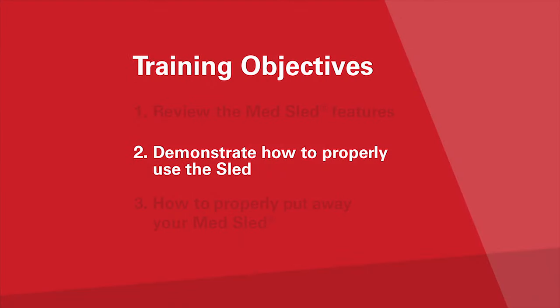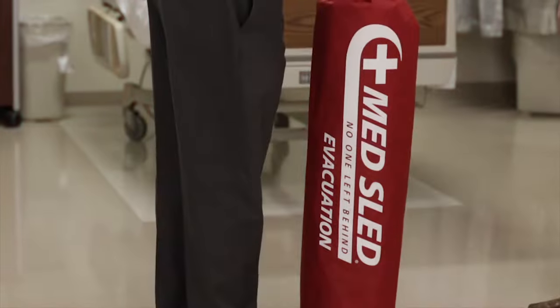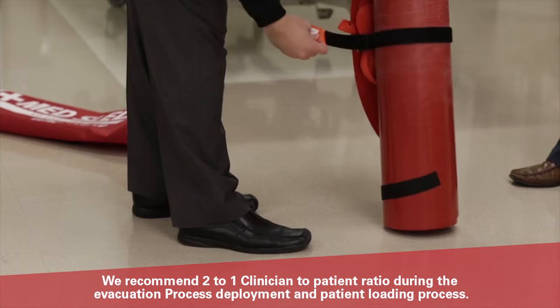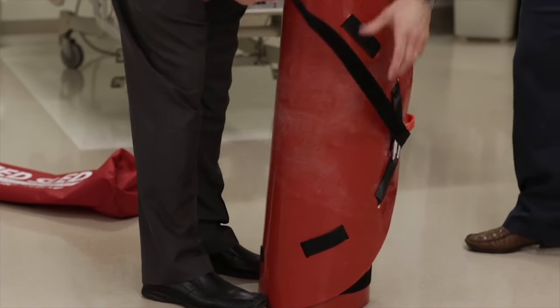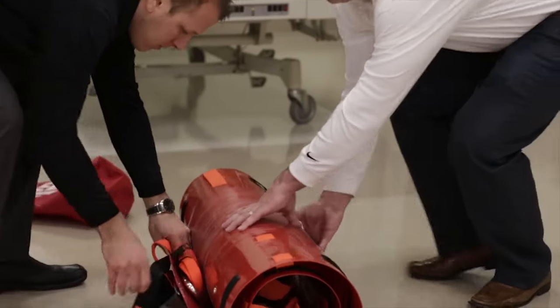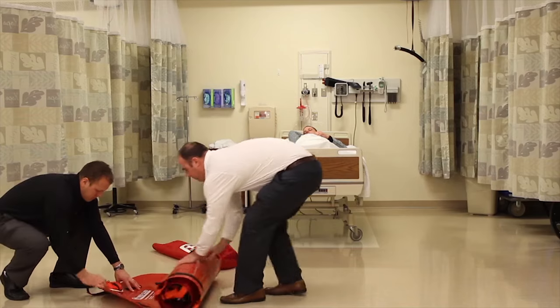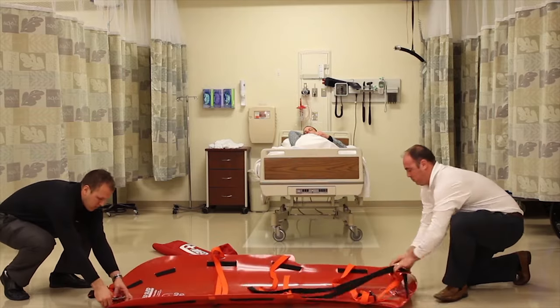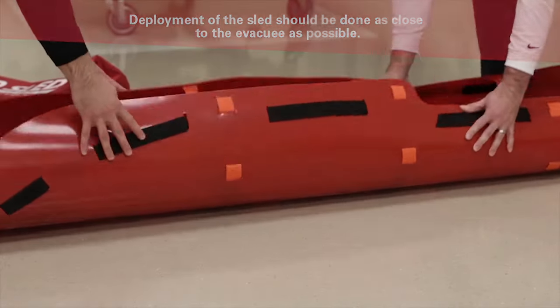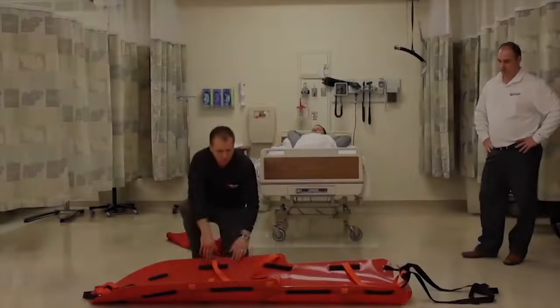We are now ready to demonstrate the use of the MedSled. All three MedSled evacuation sleds work identically. For the demonstration, we will be using the standard MedSled. We recommend that clinicians take the primary role for the deployment and loading of patients as they have the best understanding of their health issues. Once the sled has been removed from the bag, unfasten and release the orange cinch strap and secure under the perimeter tether. Place sled on the ground and unroll. After unrolling, pinch the sides inward, holding in place for two to three seconds. The sled is now fully deployed and ready for patient loading.